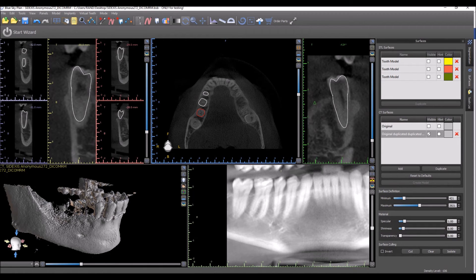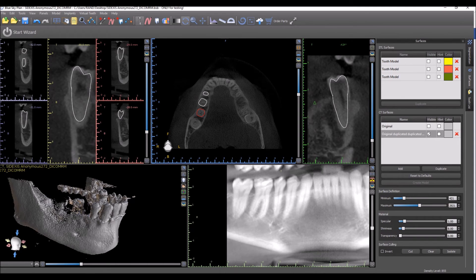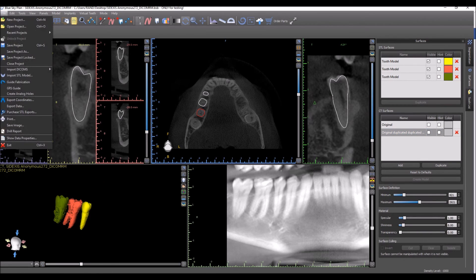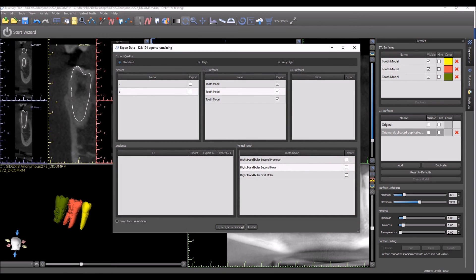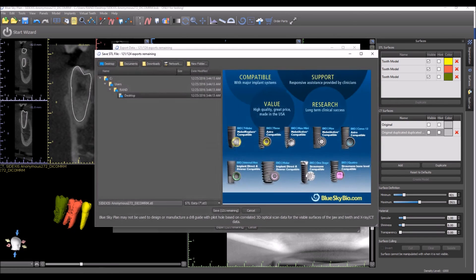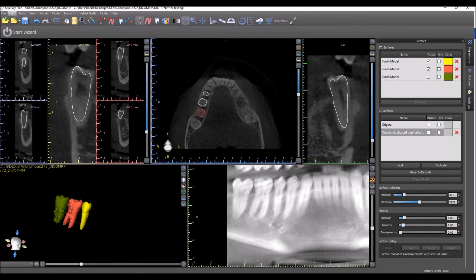Another option — if we're going to be using this case for a surgical guide and we wanted to group the teeth together into one STL file — a simple way of doing that is to export it as an STL and re-import it using the direct functionality, and it will all be grouped together. So what we would do is go to File, turn on the teeth surfaces, turn off others, go to File > Export Data, and export the STL of the teeth.